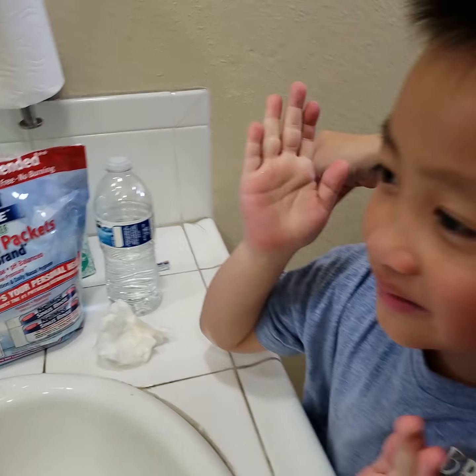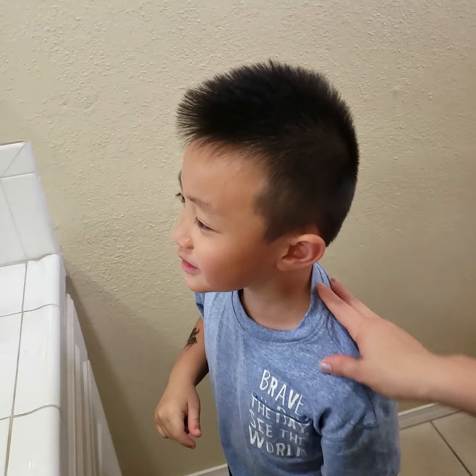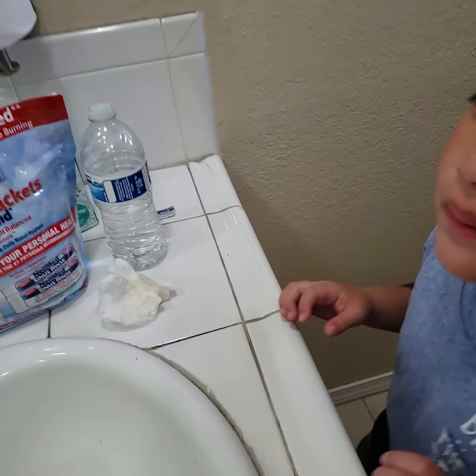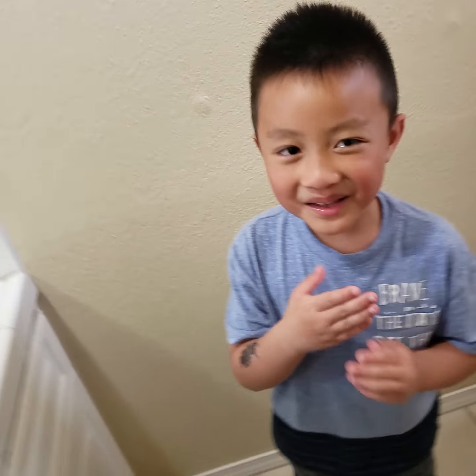I feel bad. It feel bad? Yes, I feel bad. Do you feel better? Do you see it in the nose better? Okay, let's do it on the other side. Ready? No, come on.